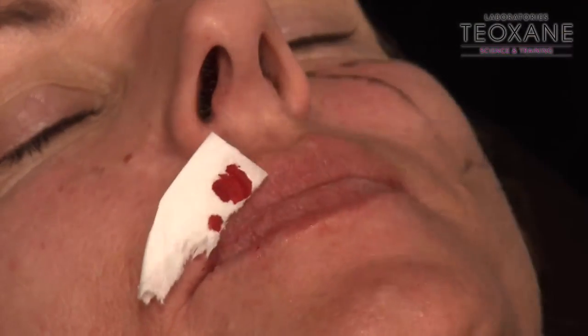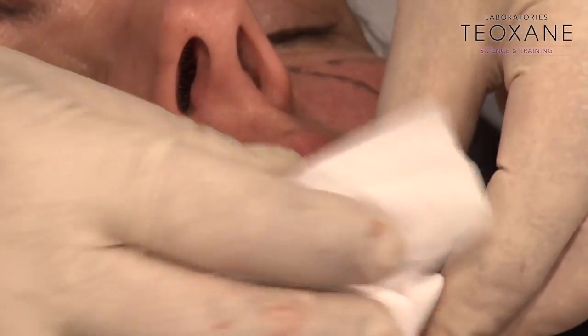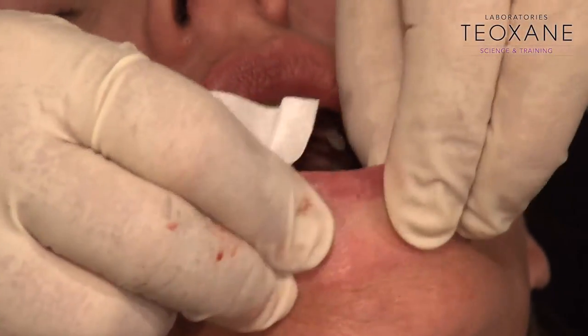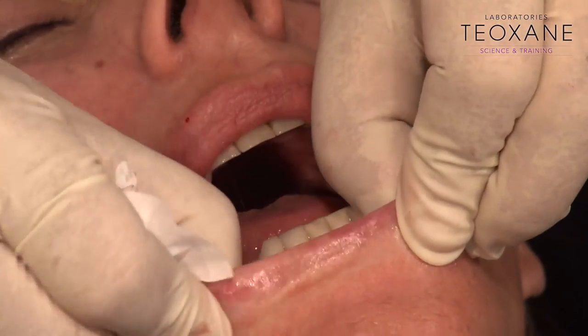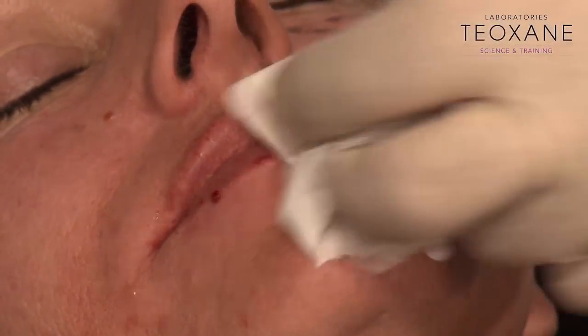Okay. Same thing. I have to sculpt my filler. Open your mouth, please, to be sure it's even all along the rim. We could see it very nicely, how the product is going in the channel.